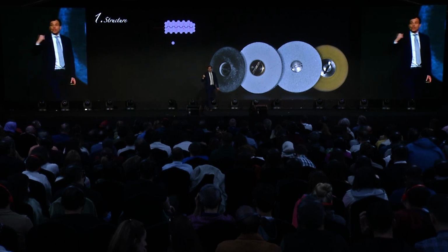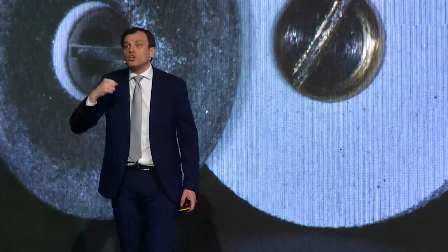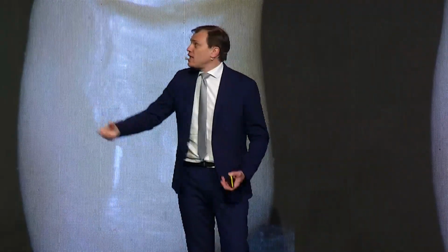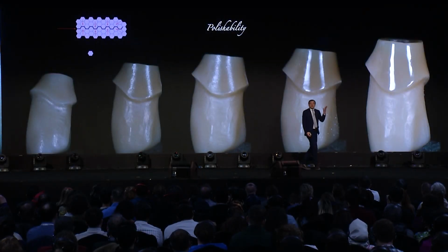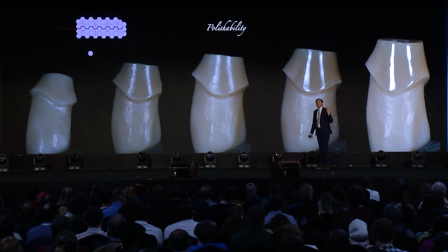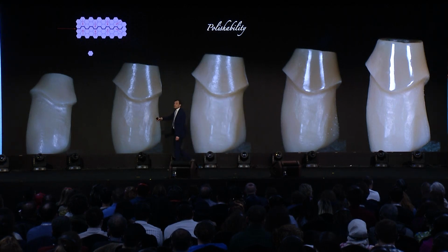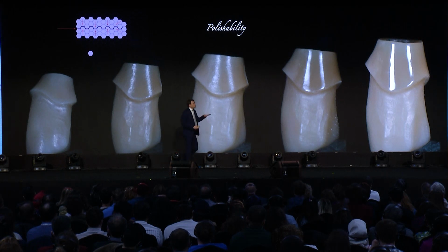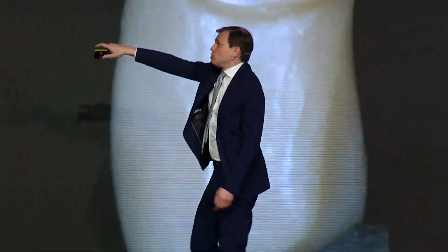As I mentioned, I look at polishability from the structure point of view. It means that with polishing tools, I can smoothen zirconia from a rough surface like here, when it comes from the milling center, to the smooth, mirror-like surface over here. We have the protocol. We know what happens with the smoothness of zirconia with each step. The question, of course, is, do we need that? Because from here to here takes two things. One is time, the other is money.